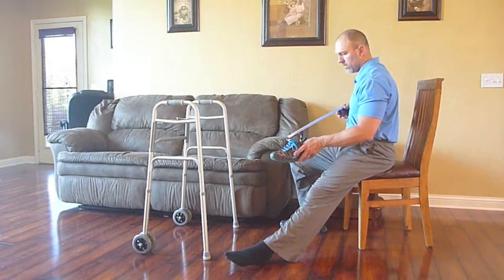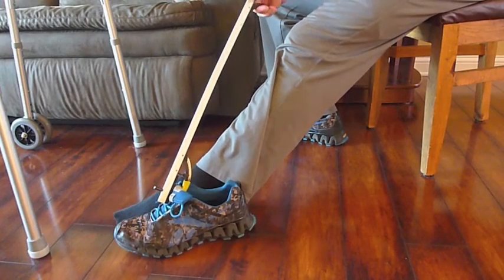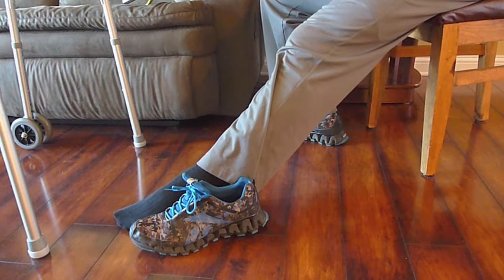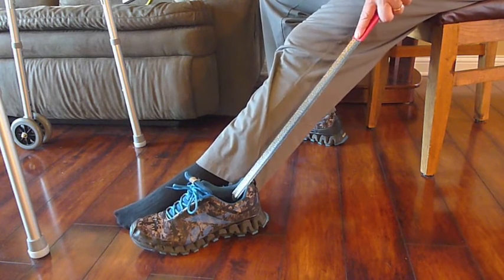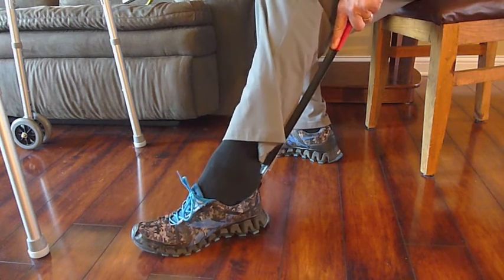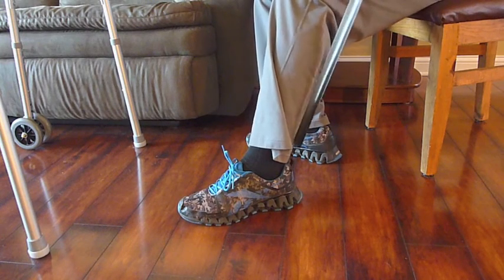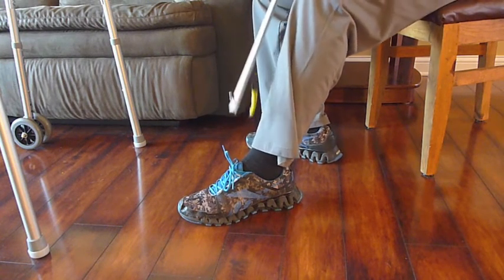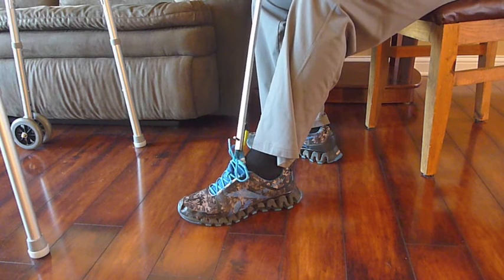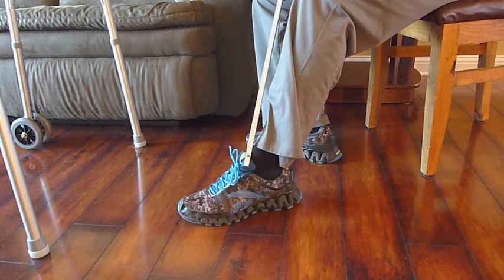Use the reacher to place the shoe on the floor just on the outside of the foot. Adjust the shoe position as needed, and then place the long-handled shoe horn in the back of the shoe, sliding the front of the foot into the shoe using the shoe horn to guide the heel. Again, the reacher can be used to make any minor adjustments to the tongue of the shoe and or the shoe itself to make it comfortable.